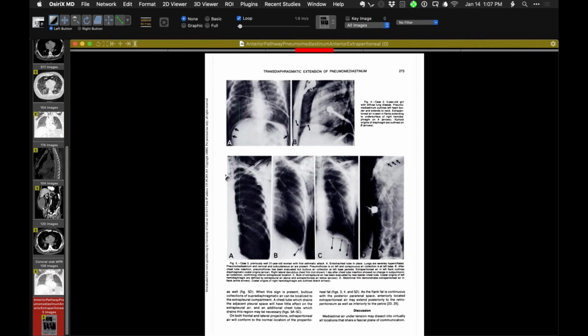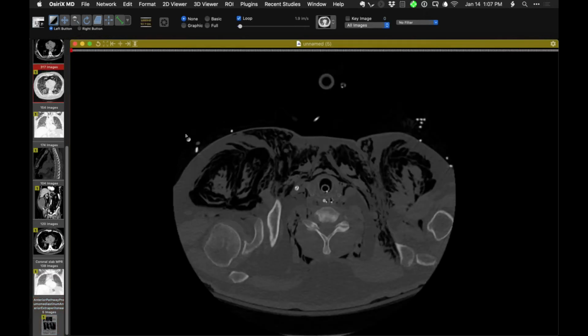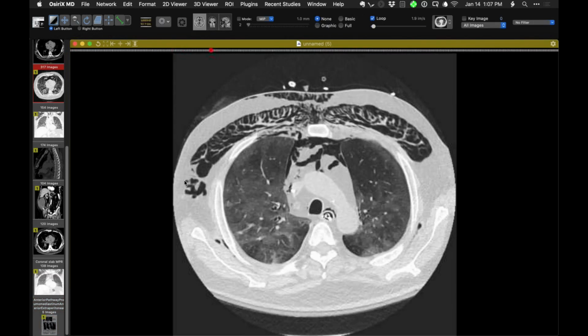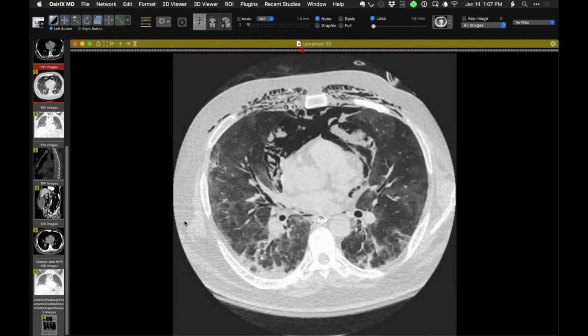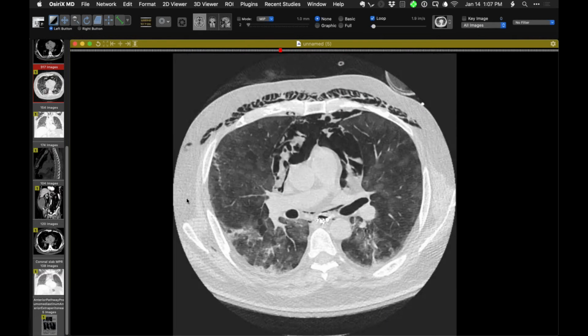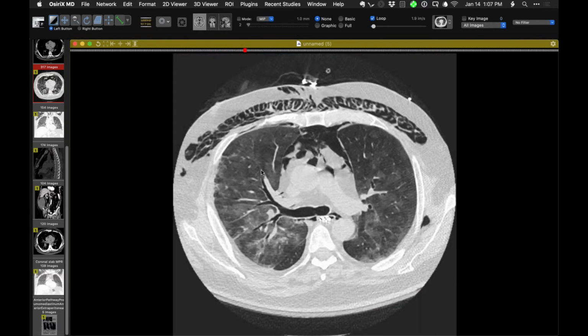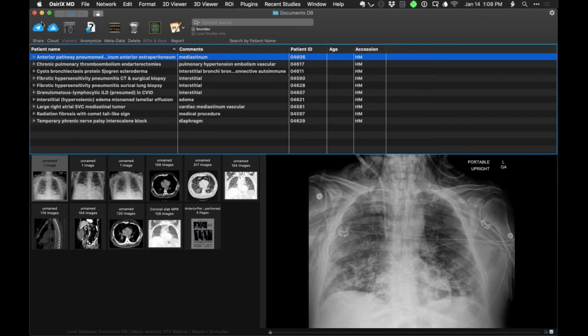It's just a nice example of that in this particular case, and certainly not something that deserves remotely the label of diaphragm rupture. And this might be a COVID patient, but I must admit right now I can't quite remember. I think this was attributed to the Macklin phenomenon. So just a reminder of that particular pathway as an explanation for connecting up the air.